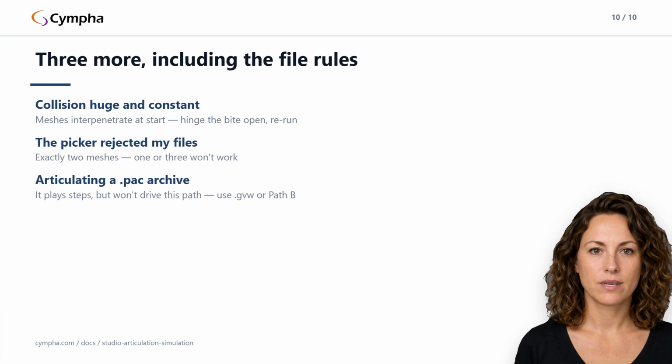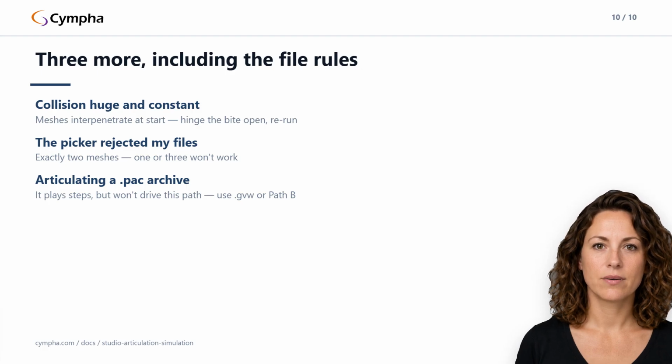All of this is written up, hint by hint, at cympha.com. Open Docs and find how to simulate lateral excursion in Cympha Studio.